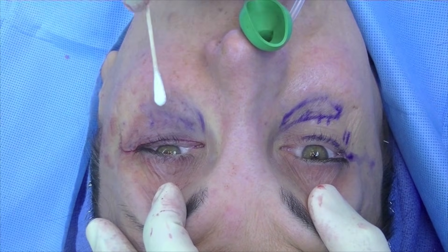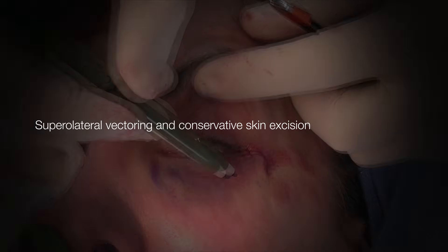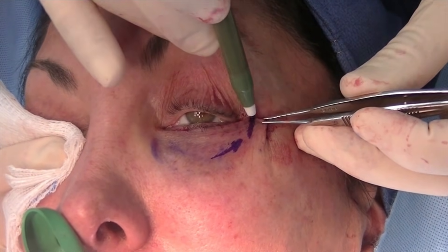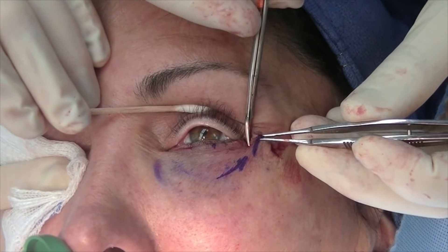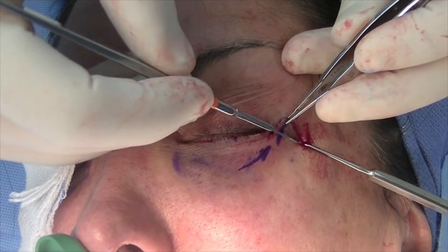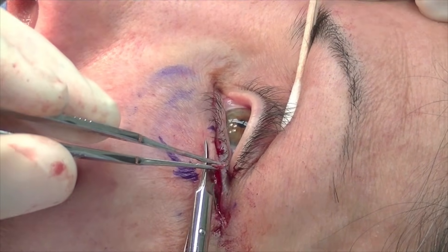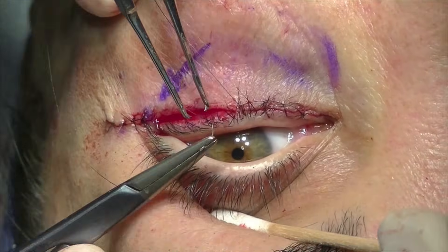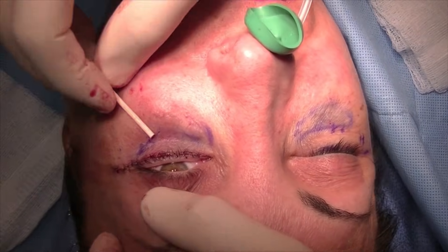We now see good filling of the orbital hollows as well as re-draping of the orbicularis muscle. A vector and conservative skin excision is now performed — the flap is re-draped in a more superior-lateral fashion, with more skin excised in the most lateral aspects, approximately 6 or 7 mm there, and only 1 or 2 mm medially. A single hook is placed and the lateral skin is sharply excised; continuing medially there is approximately 3 mm, then at the pupillary margin essentially no skin is removed. After closure, we see good re-draping of the orbicularis, removal of excess skin, and filling of the infraorbital hollows.